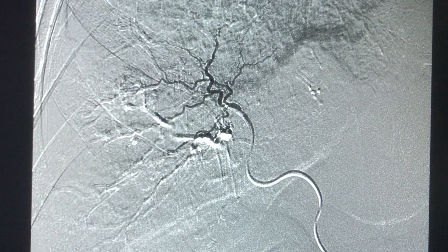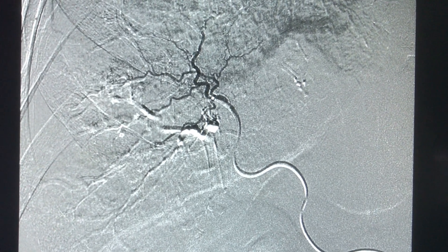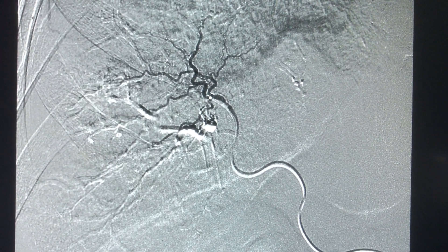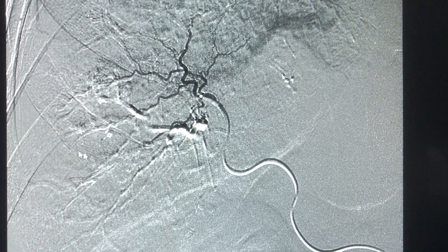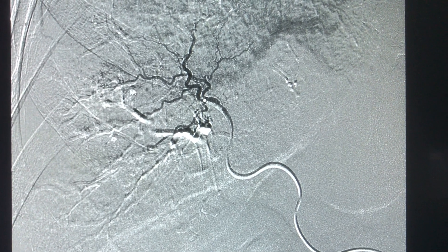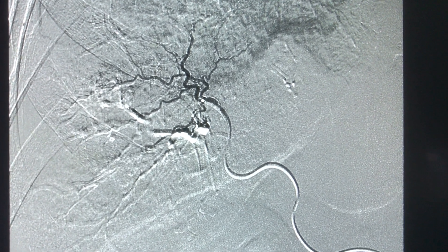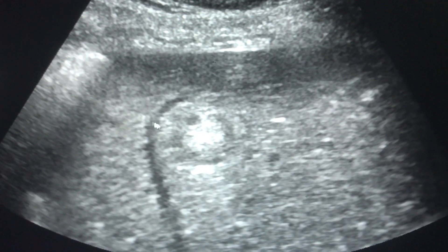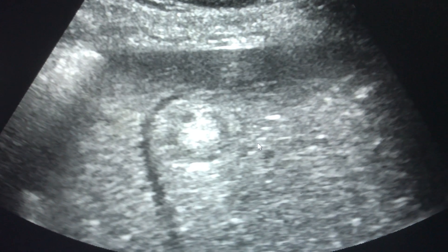Once we have found the tumor, we inject a special mixture of chemotherapy agents and beads into the tumor bed and basically stop the blood supply to that tumor. Because we're doing dual therapy, this is what that tumor looked like prior to injecting the artery with the oil and chemotherapy mixture.